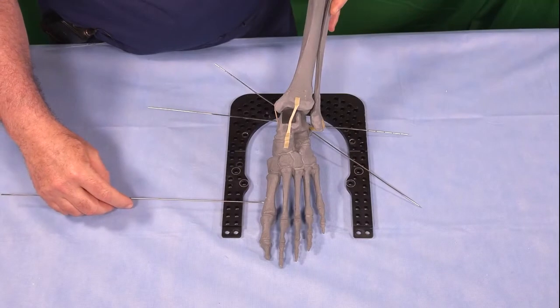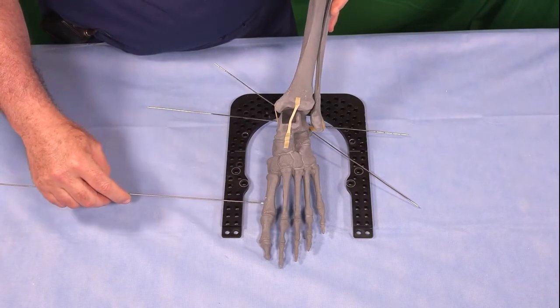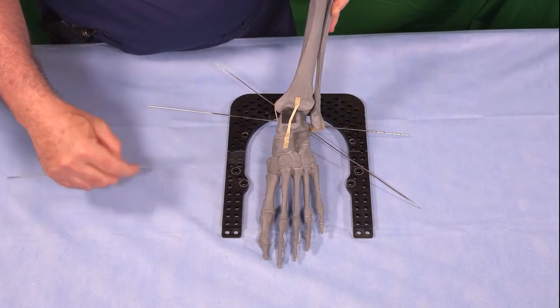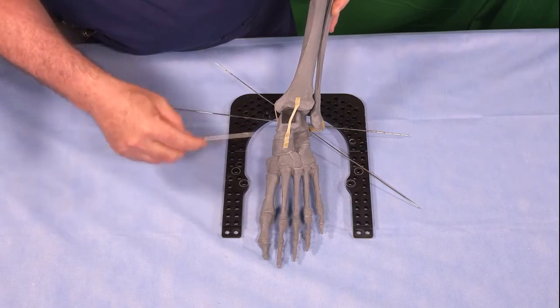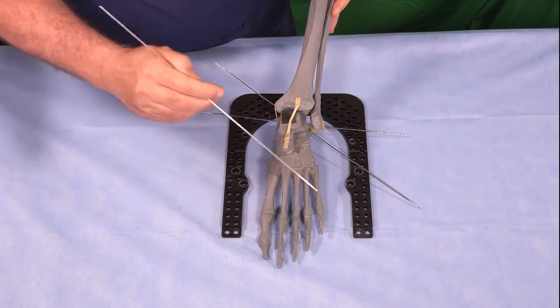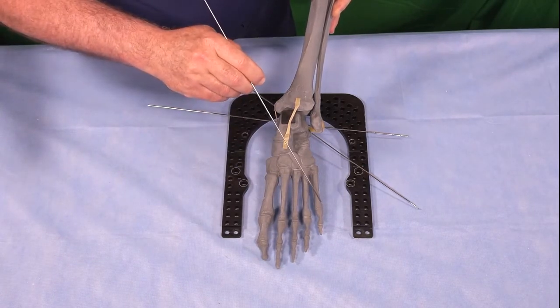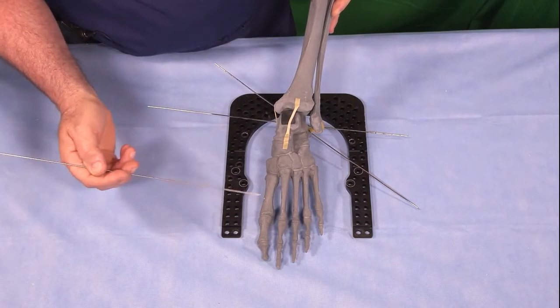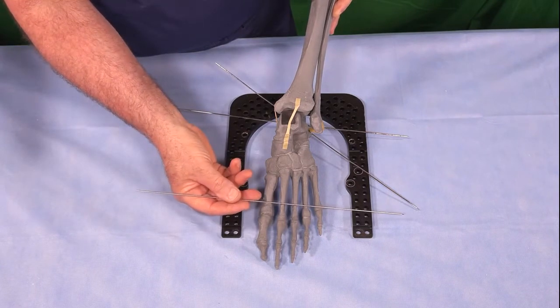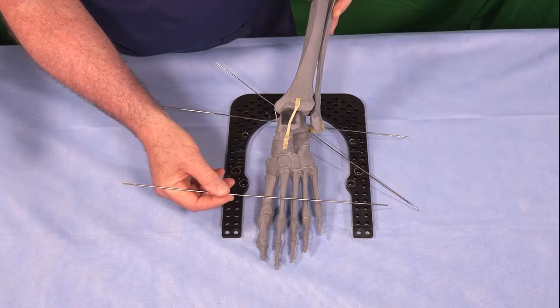Next, I'm going to place a third wire from the fifth metatarsal to the first metatarsal that is perpendicular to the foot. And then I'll have good fixation of the forefoot and the hindfoot. This wire shoots uphill because there's a transverse metatarsal arch. So I want to start from the top of the fifth and aim for the bottom of the first. If I miss some of the middle ones, that's okay. And this wire ideally should be parallel, but sometimes it ends up being a little bit sloped upward because of the arch of the foot.